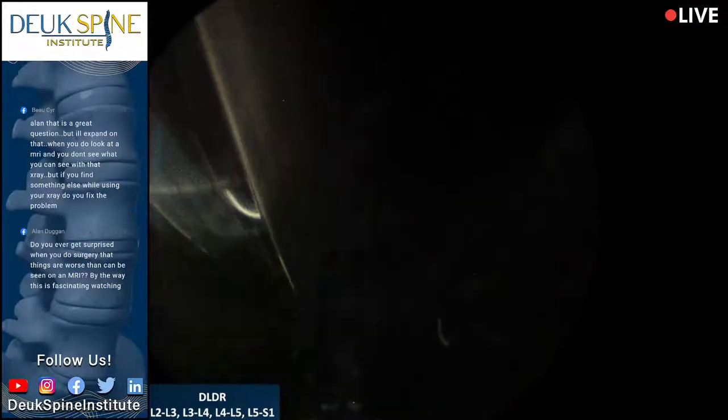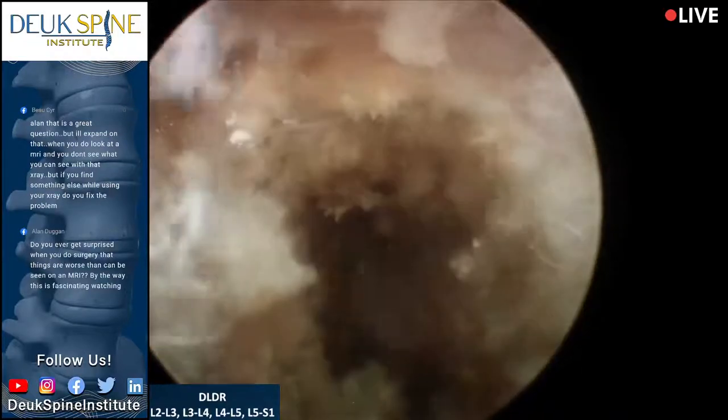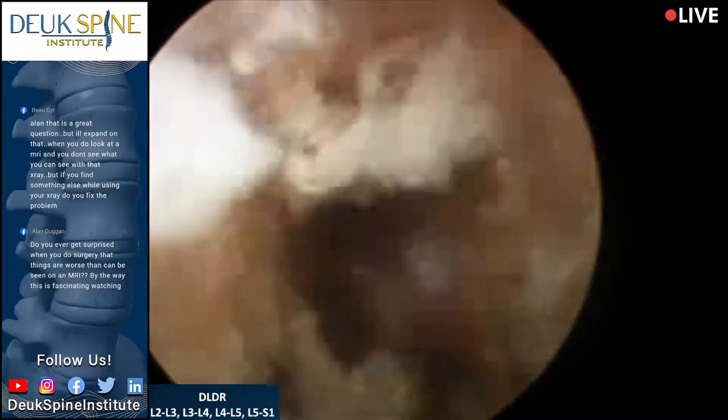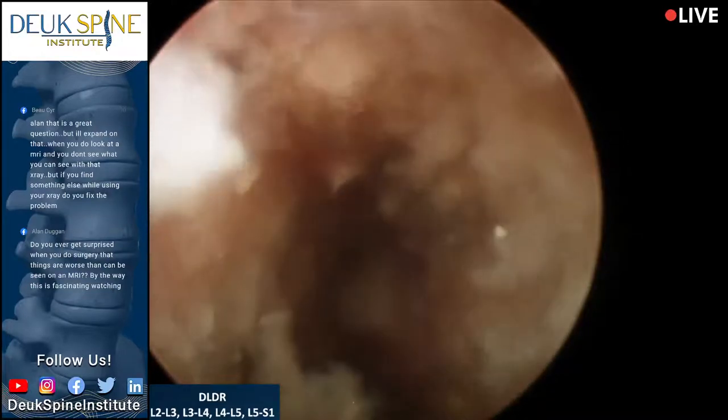But we've gotten rid of the source of his back pain at this point. So I'm pretty happy with that. Let me just see, Luis, if I can fish out any more free fragments that are loose. I don't want them coming out tomorrow or the next day. So we know we're going to be fixing the other side of his spine. This patient is having both sides done.